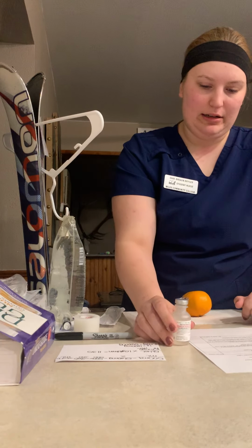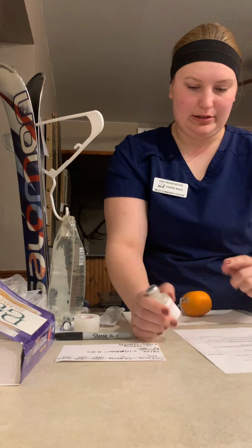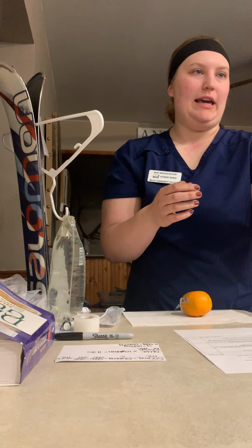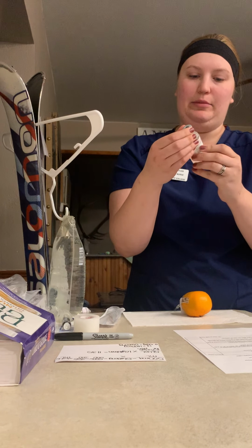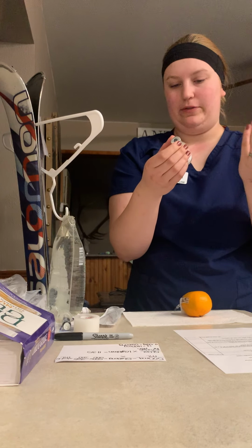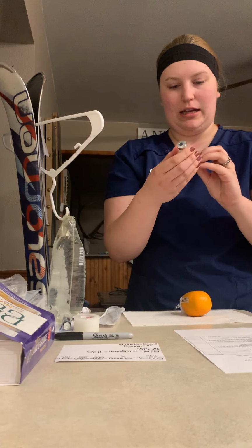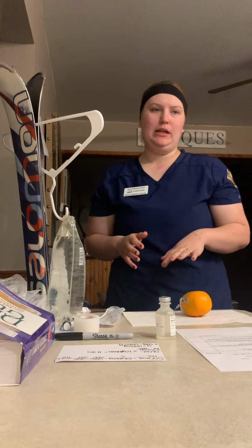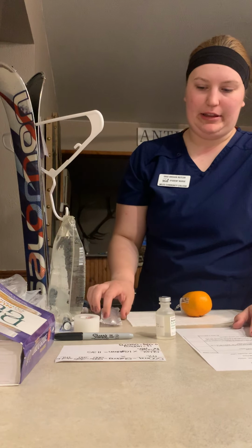I'm just going to do my check after I pull my medication out, make sure I got the right med, make sure the solution looks okay, check my expiration date, which is October 1st, 2020, and everything looks okay. So now I'm going to go to my patient's room. Oh, and I gathered all my supplies and everything.